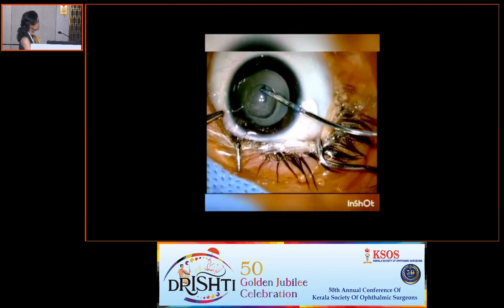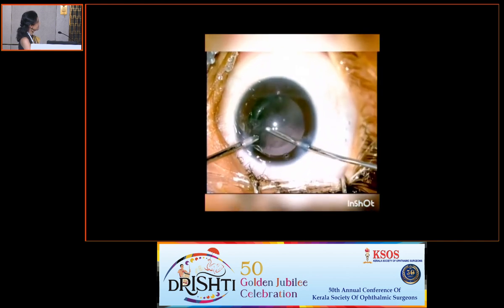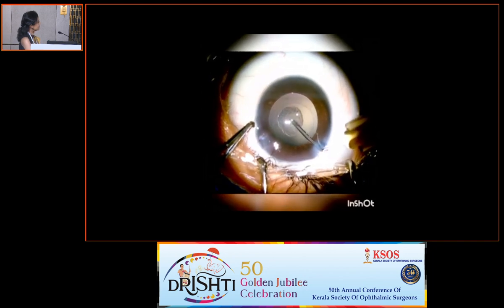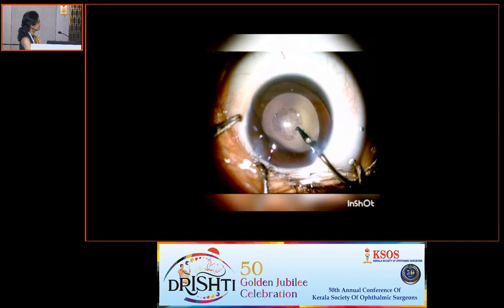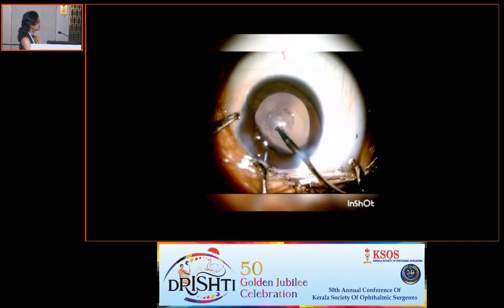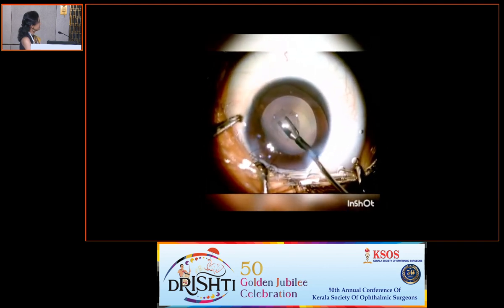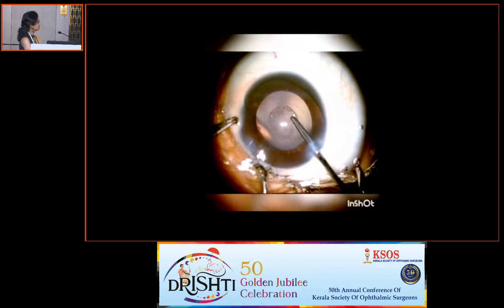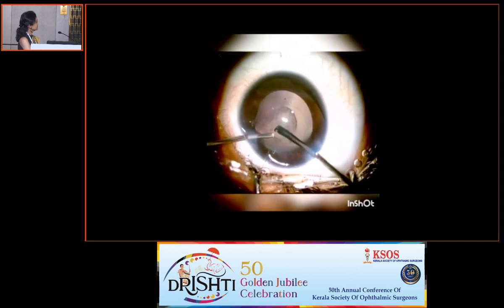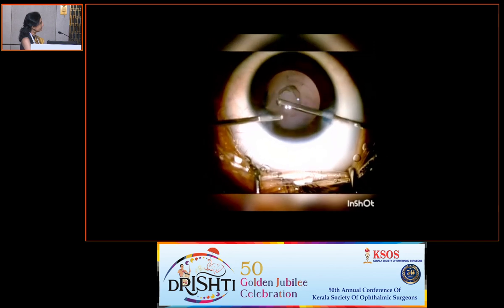After a careful anterior capsulorhexis, we proceeded with irrigation aspiration of the lens matter bimanually, keeping the parameters low. Post lens aspiration we found a posterior capsular opacity, and on trying to do the posterior capsulorhexis I found that there was no posterior capsule there. It was just an area of lens epithelial cells bridging the defect. So a vitreorhexis was fashioned with the vitreous cutter, and an anterior vitrectomy was done to make the posterior capsular opening and to clear the visual axis.